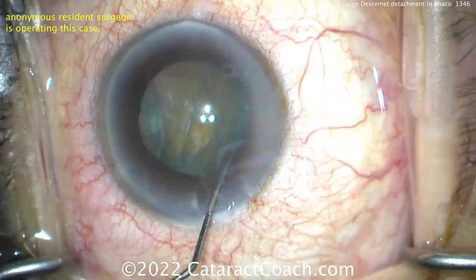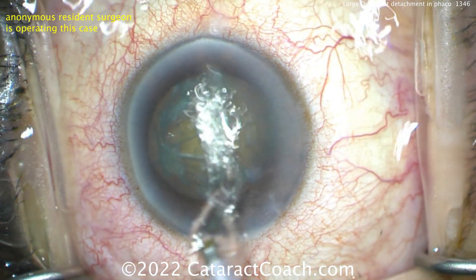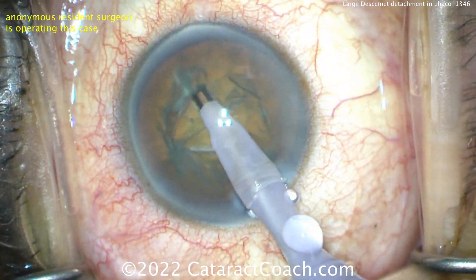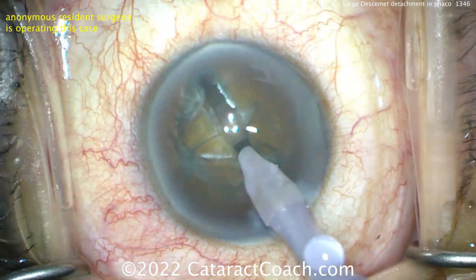Remember: if it does not spin, you will not win. But it spins, so that's a good thing. You can see the incision now — it's got a little bit hydrated on the stroma walls, and that is a reasonable incision. It looks like a groove down the middle, maybe a stop-and-chop or divide-and-conquer technique. Reasonable looking groove.